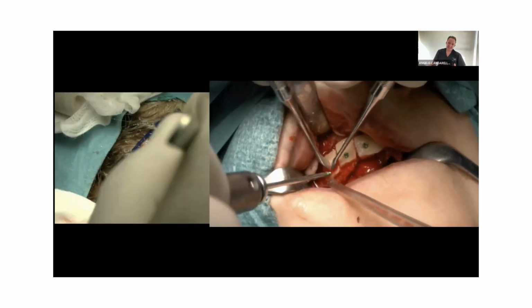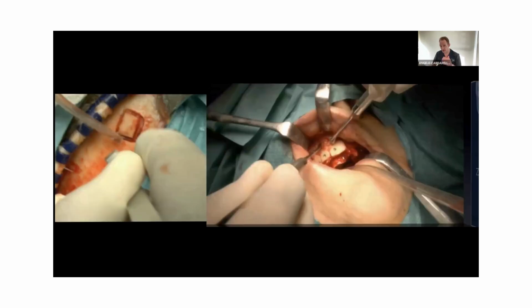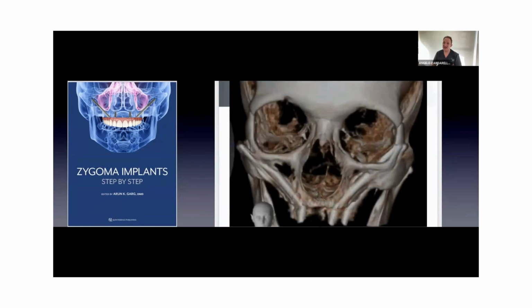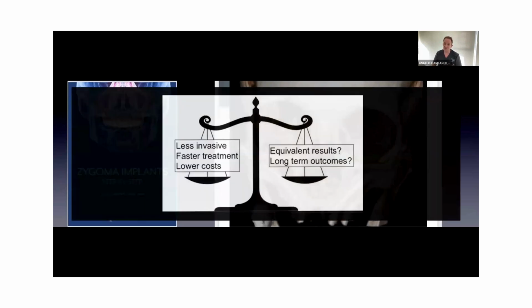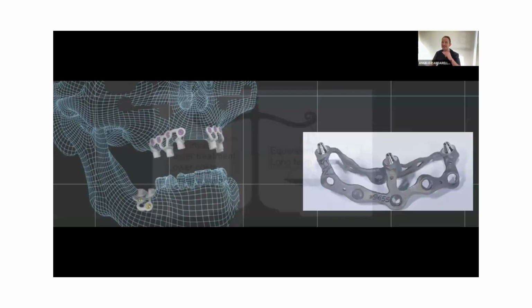That's why, instead of this kind of bone regeneration, another approach is the zygomatic implant, for example in the maxilla, for sure. But as you know, in the zygomatic implant, the problem is related to complications. Because if we have some complication with the zygomatic implant, it's very hard to solve, and also we can have a lot of problems. That's why now we have another option. We can use the customized implant, reducing the invasivity, reducing the morbidity, but maintaining the same outcomes.